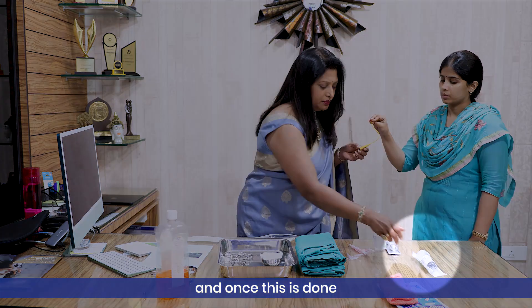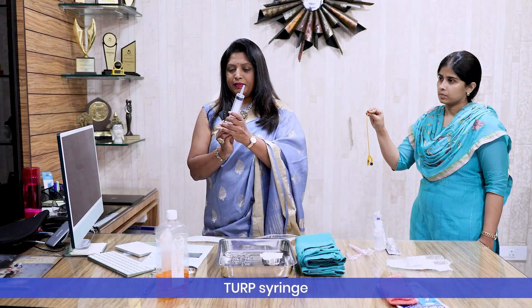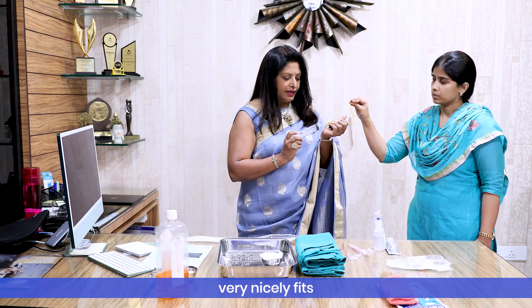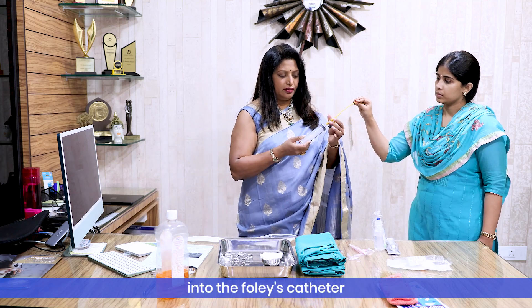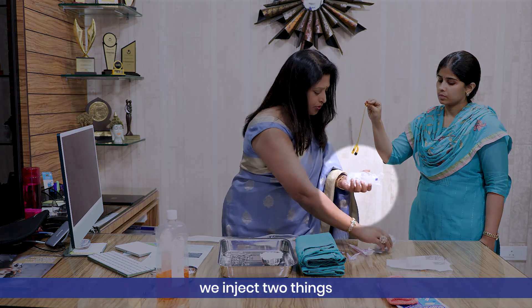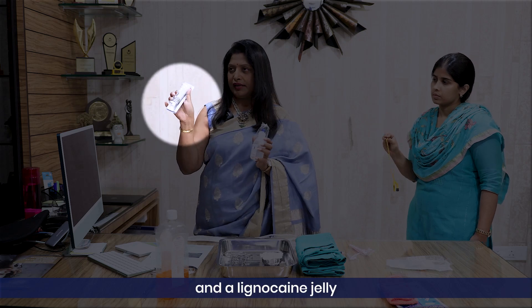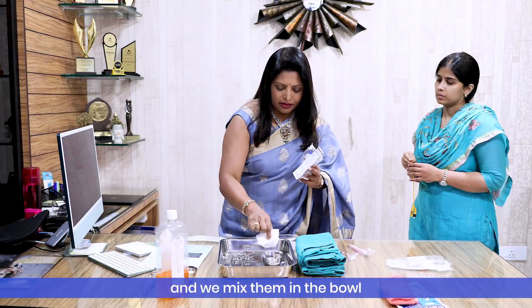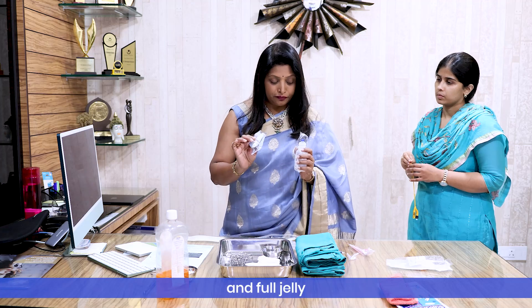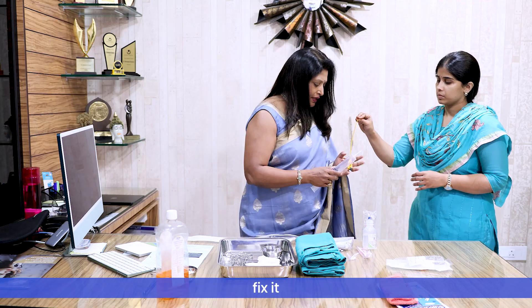Once this is done, we take a 50 ml TURP syringe which has a conical tip that fits nicely into the Foley catheter. We inject two things: we take 100 ml of normal saline and lignocaine jelly, mix them in a bowl, pour in the saline, add the full jelly, and then aspirate that into the syringe.